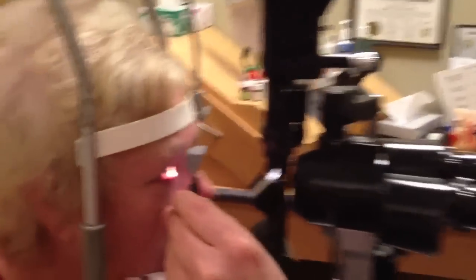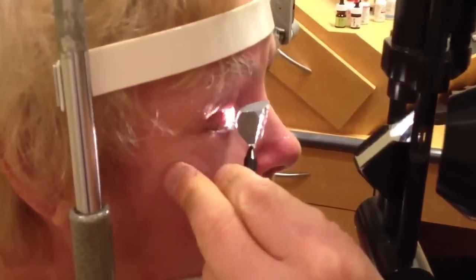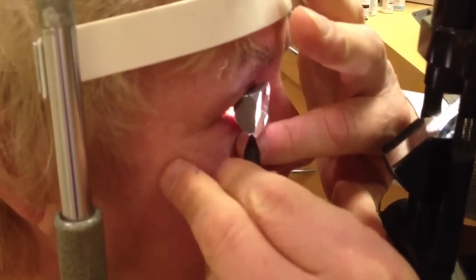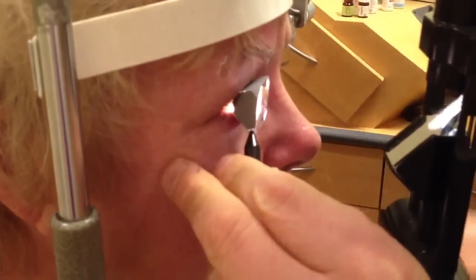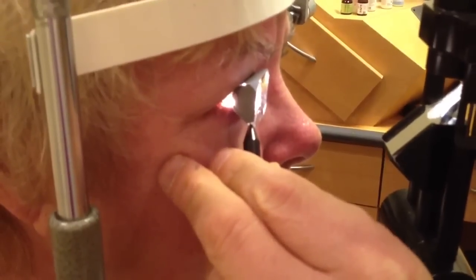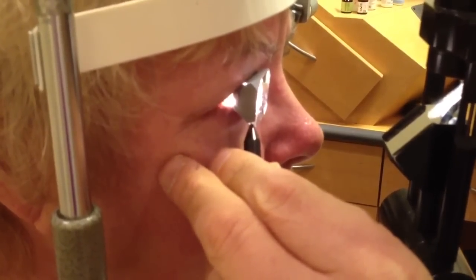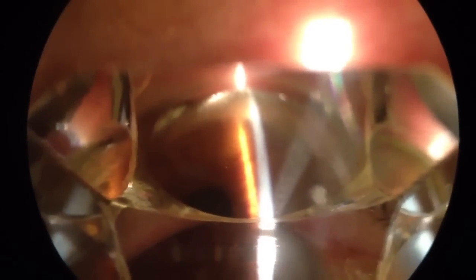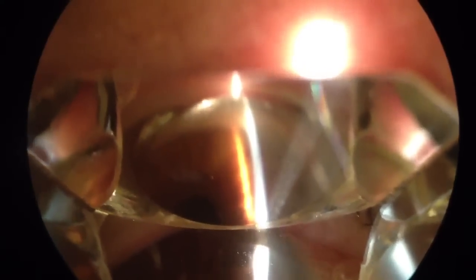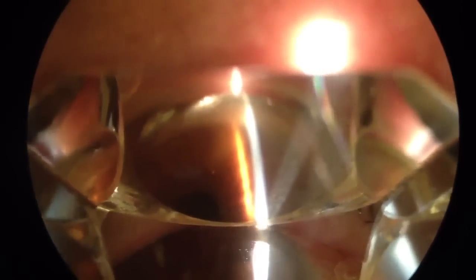So let's show you how it's done. The eye is numbed, and the lens is applied directly to the surface of the eye. Looking through the mirror, you can see the reflection of the iris below and the cornea on top, and the space in between is called the anterior chamber angle.